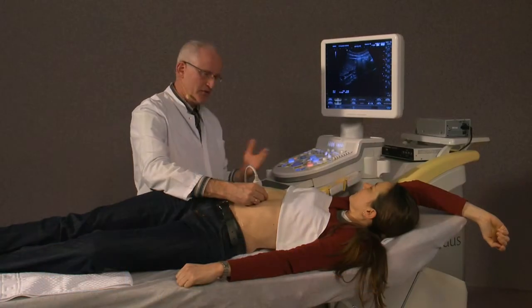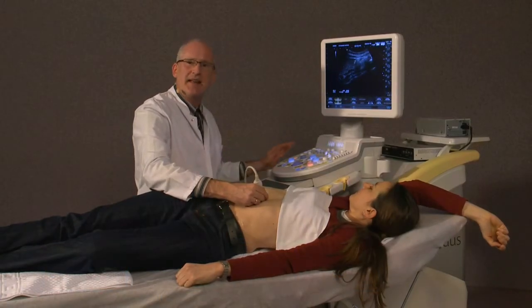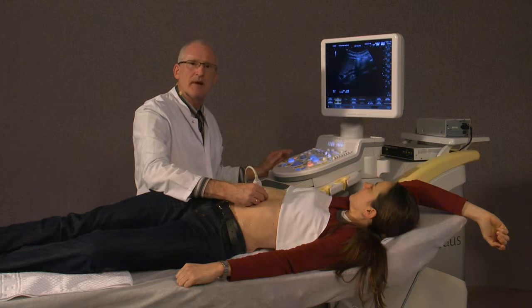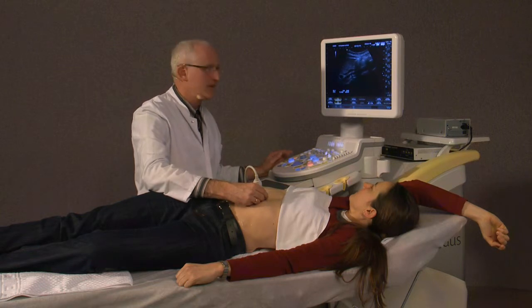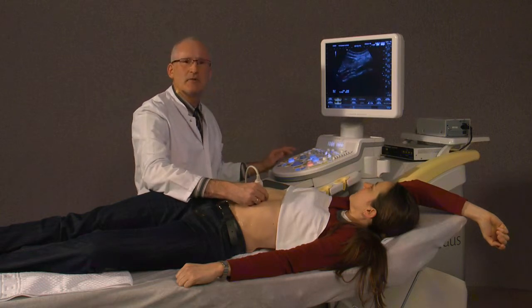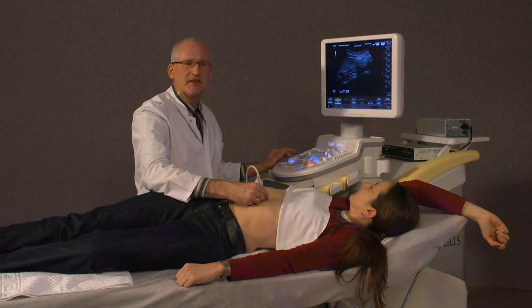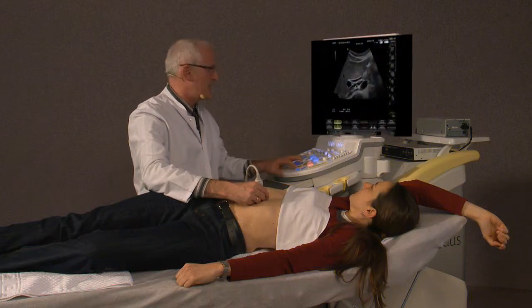In the same position as for the examination of the common bile duct, we examine the liver hilum for lymph node detection.